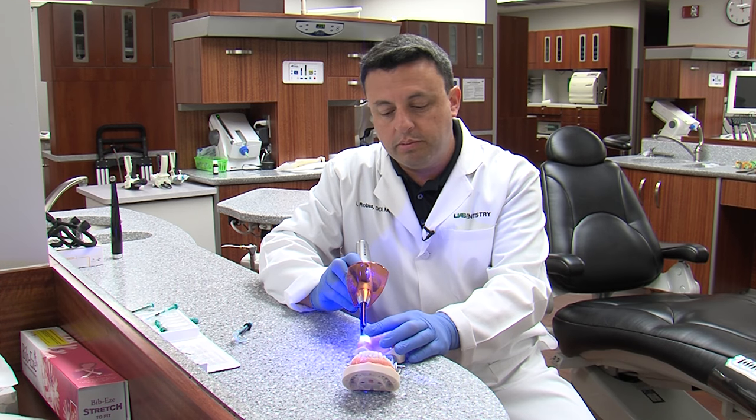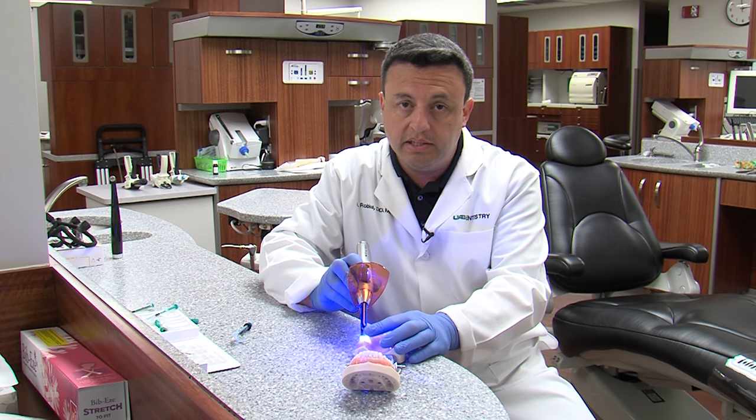Once the resin becomes hard, it becomes part of the tooth. In that way, it restores the part that is missing or affected.